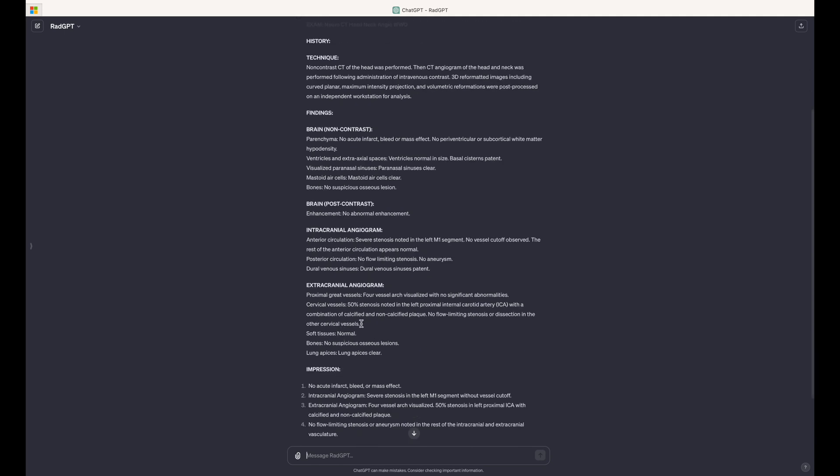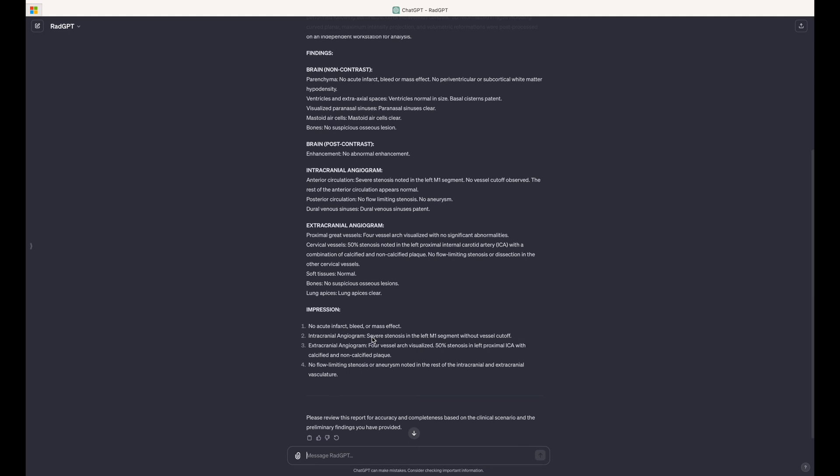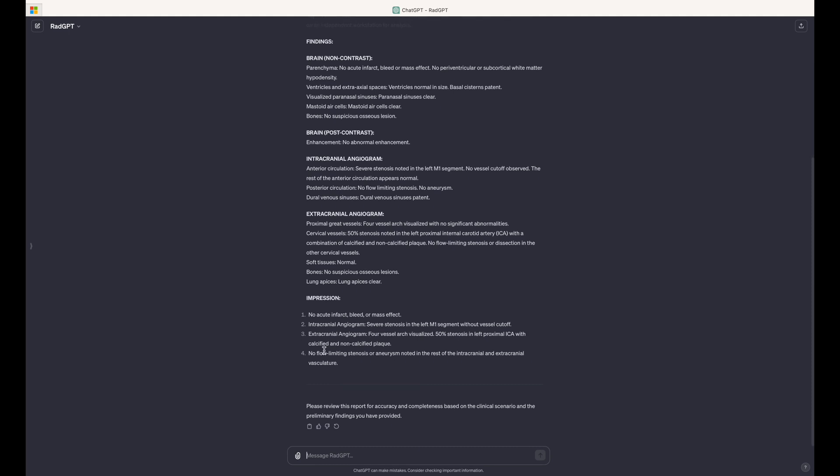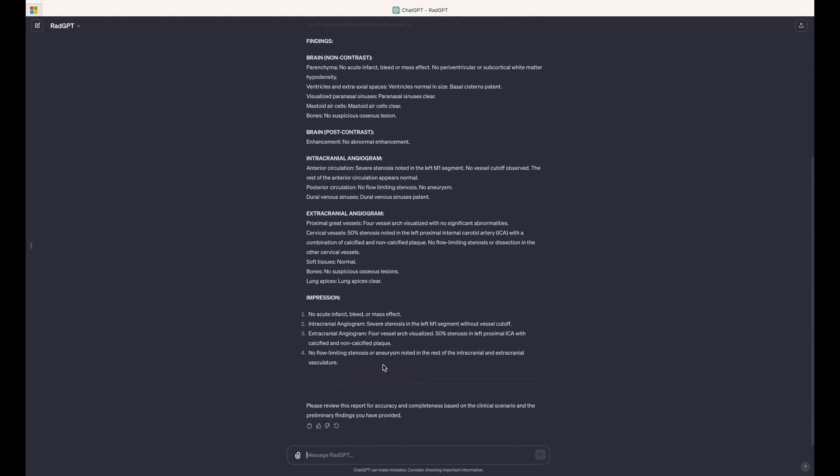And then we move down to the neck findings and you can see it's inserted 50% stenosis in the left proximal ICA in the correct location in the extracranial angiogram. And then under impression, those major findings are included.